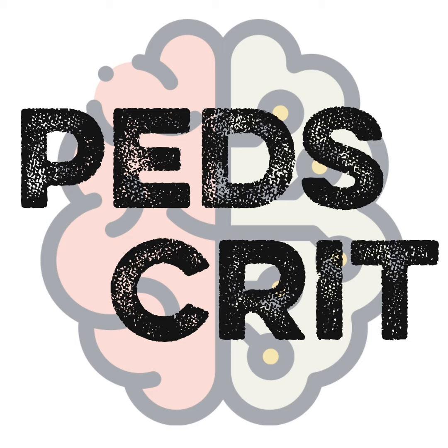Hepatic encephalopathy of any degree potentially puts the patient as a candidate for augmented clearance. And that might be TPE, or TPE and/or MARS, depending on the size and age of the patient. Hepatic encephalopathy in a very young patient might be CRRT plus TPE, and we would do TPE daily. So we will change the CRRT circuit only when we routinely need to change it, every 3 days, but we would do daily TPE, twice volume exchange, fresh frozen plasma replacement only, tandem, meaning we do it in parallel. We're using the same circuit as the CRRT circuit with a centrifugal plasma exchange platform.